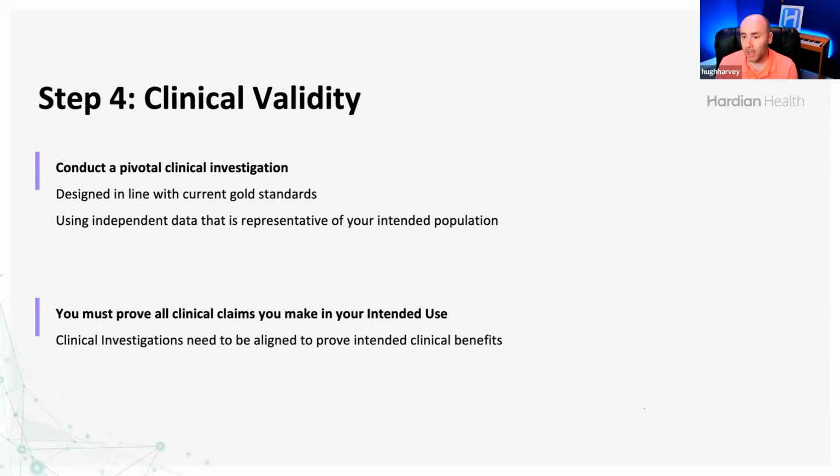Lydia, is there a single or standard few sources for searching regulatory and adverse events databases? That's an excellent question. So yes, when you're doing a literature review, you have to pre-specify which databases you're going to search. Typically people might use PubMed, the Cochrane Library, Google Scholar for the academic references. But there are regulatory databases as well. In America, you look at the FDA MAUDE database, which will detail any side effects or adverse events.